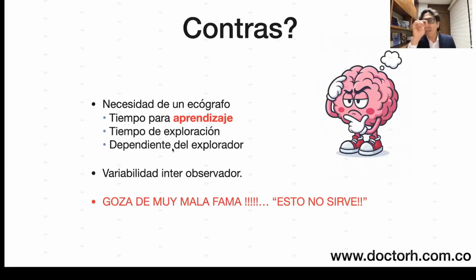Relying on the examiner is a paradigm we must eliminate. I can't rely on others. I need to do it myself. To reduce inter-observer variability, we must improve through self-learning. If I depend on the radiologist, who isn't examining the patient, nor a clinician or surgeon, then obviously we're going to reduce the effectiveness and benefits of this. I think the bad reputation, as of today, needs to be reevaluated.